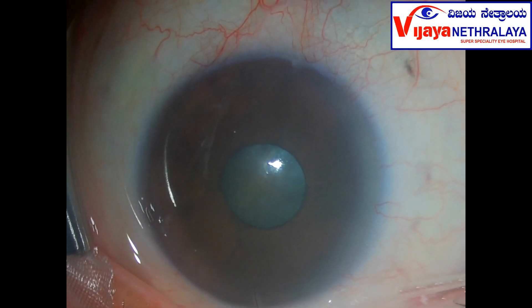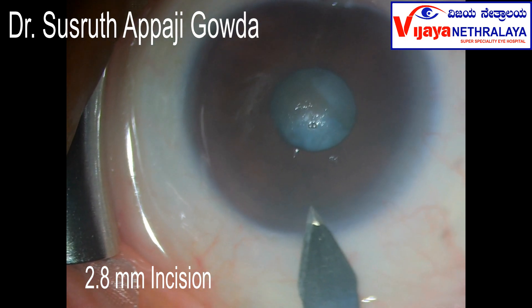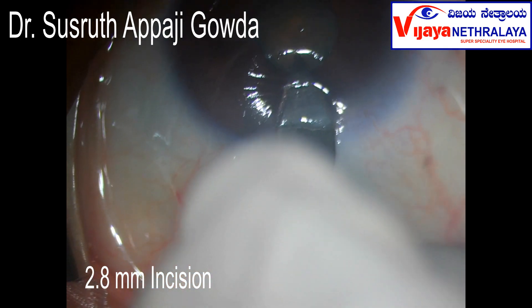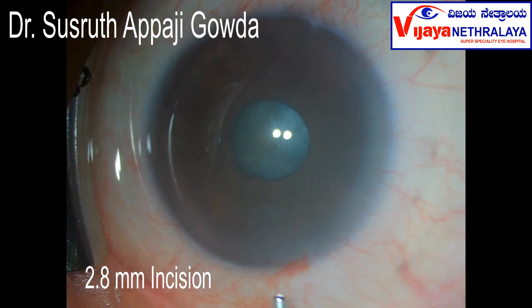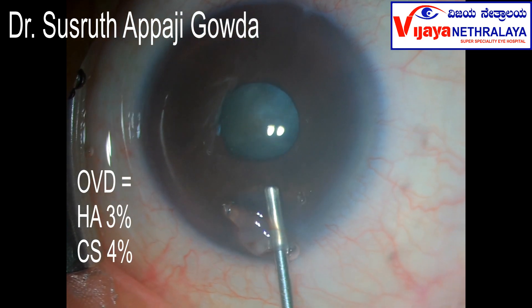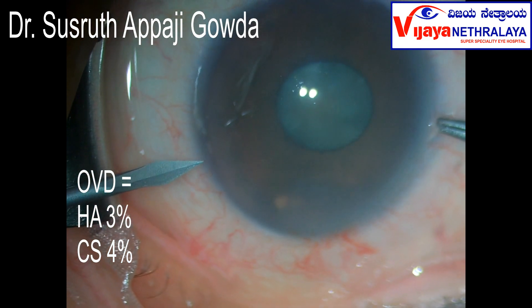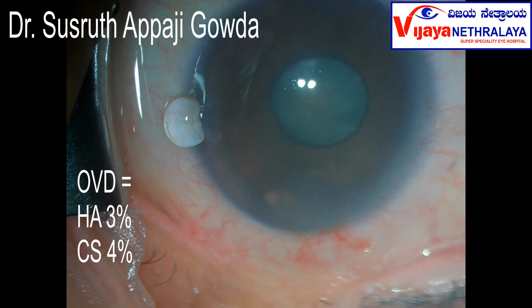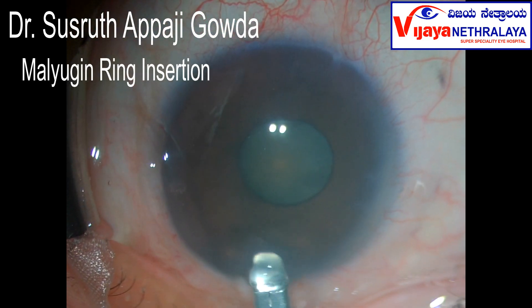This is the eye. You can see the chamber is very shallow. A valve incision was made on the steep axis in keeping SIA. The chamber was filled with cohesive and dispersive highly viscous 3% hyaluronic acid and 4% chondroitin sulfate. Side ports were made. A 6.5 mm malugen ring was used to engage the pupil and keep it expanded during the whole course of the surgery.